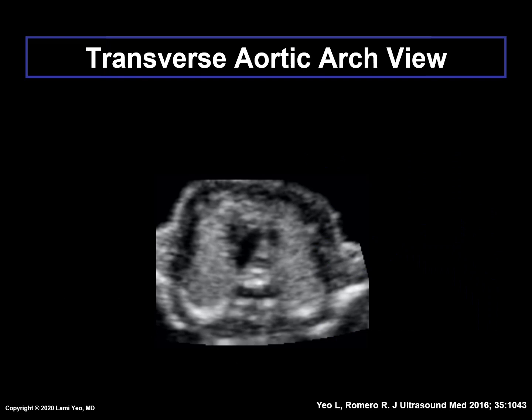In the transverse aortic arch view, two vessels are seen. The transverse aortic arch, or what we call the dolphin, has an oblique course which crosses the midline from the right anterior to the left posterior chest. The superior vena cava is visualized to the right of the aortic arch.